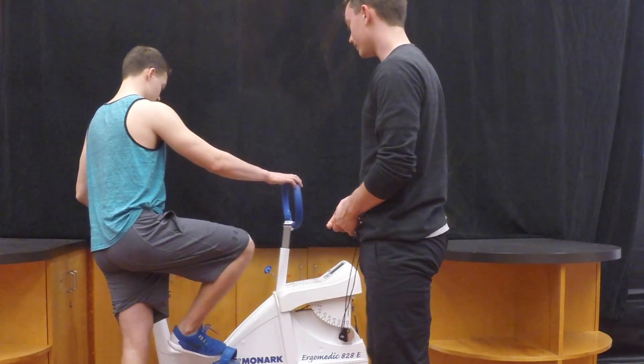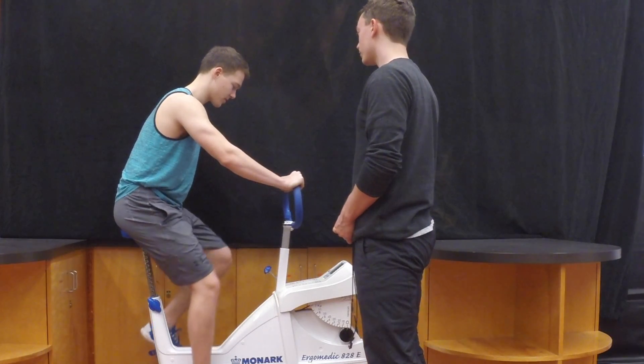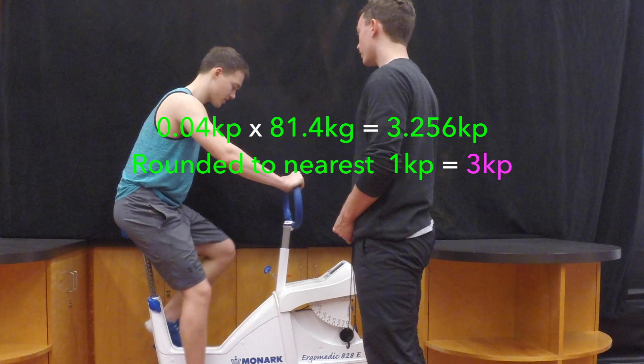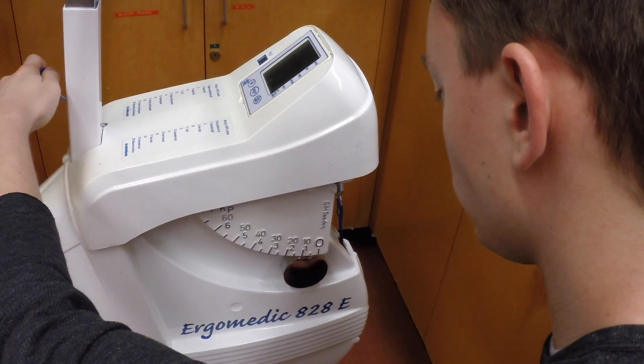Ask the client to hop on the bike and start pedaling. You're going to want to select a resistance that will produce between 125 and 170 beats per minute. The formula is 0.04 kiloponds per kilogram of the client's weight, and then you round to the nearest 1 kilopond for men and the nearest 0.5 kilopond for women. In this case, we're starting the test at 3 kiloponds. Twist the dial clockwise to bring the resistance up.